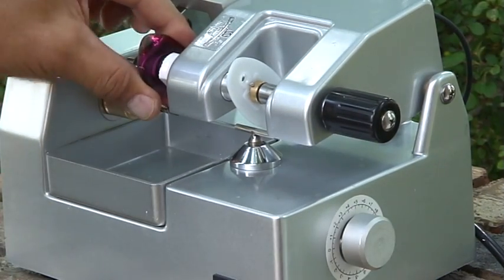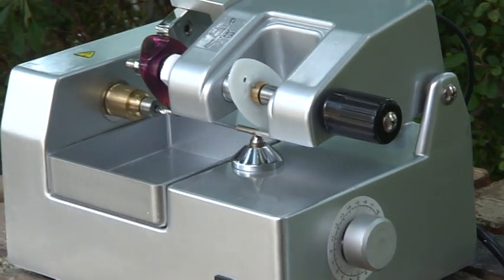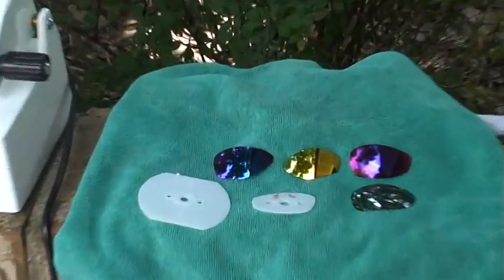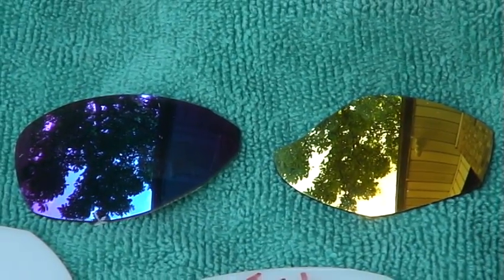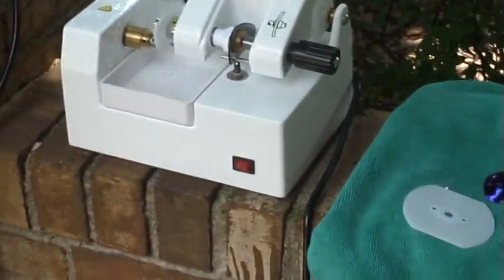So you've got to align it properly, as well as you've got to get it really tight over here. Any movement that you've got, any flex when that bit bites, and you wind up with something like the blue one there, or something like the gold one there, where it just bit and it flexed it in the suction cup mount and just really took a big bite out of it. So tightness is absolutely key.